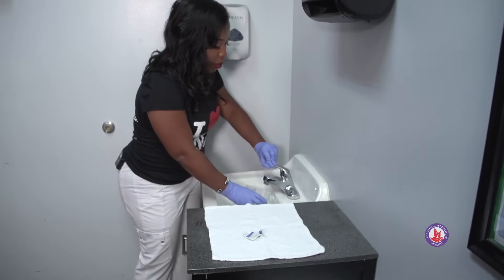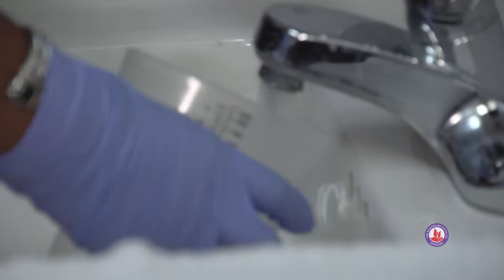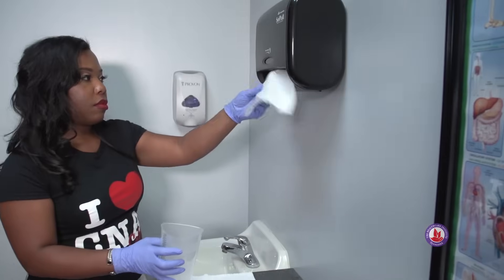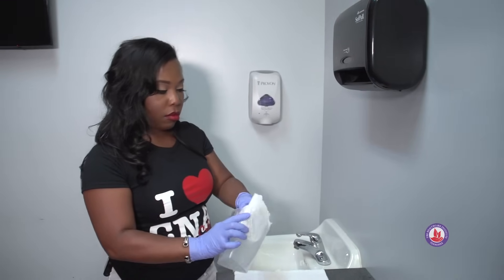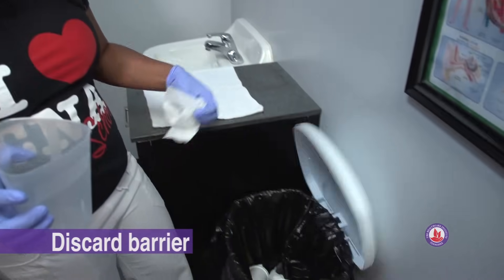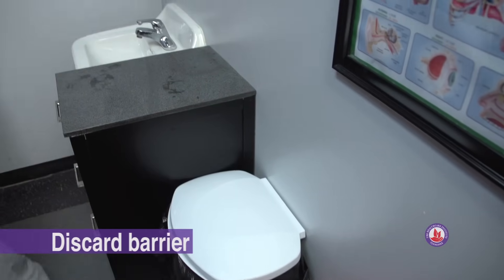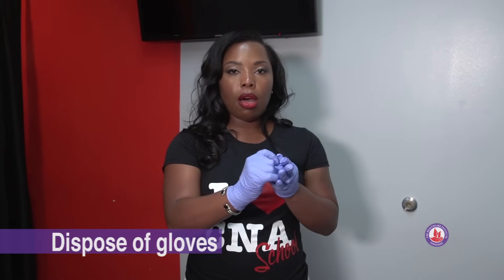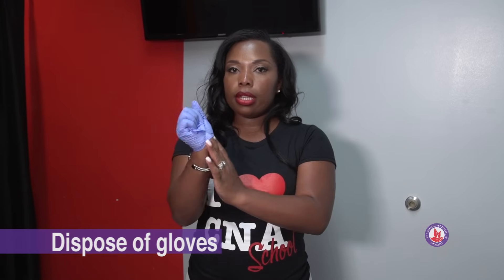We need to now rinse our equipment and we're going to dry it. Once we've dried everything, we're going to dispose of our trash in the trash can, put our towel in the linen hamper, and we're going to replace our equipment onto the shelf. Now that you've replaced the equipment, you can take your gloves off the same way that you've been taught — pinch the palm under the glove. We can dispose of these in the trash can.